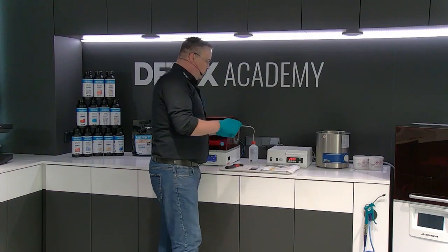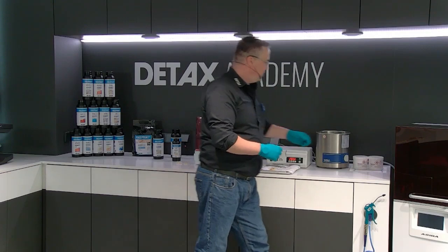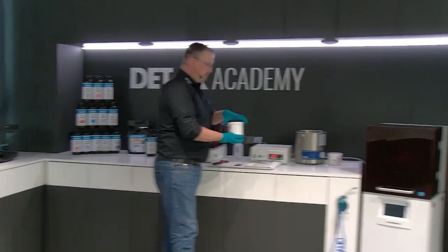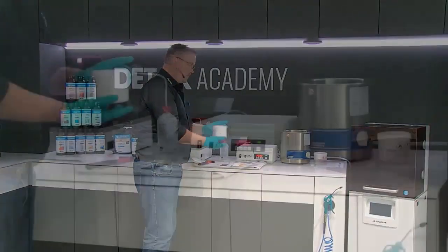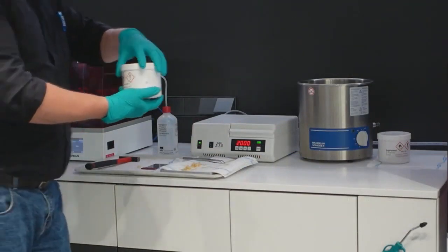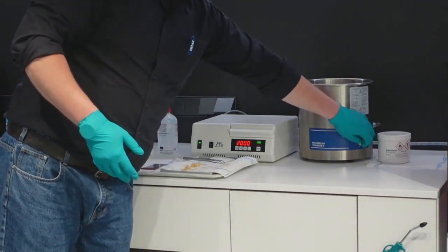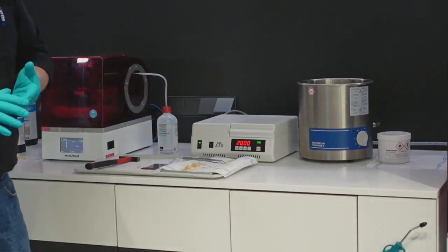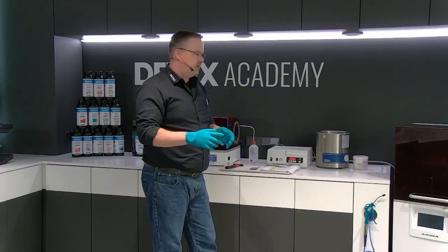cleaning step. We also blow the rest of the material away in between. We now use our bath number B, with nearly fresh isopropanol alcohol. Take it back to the ultrasonic bath, and we will start it also only for 1 minute. 1 minute is more than enough, and you don't need more cleaning steps. So this is the easiest way.